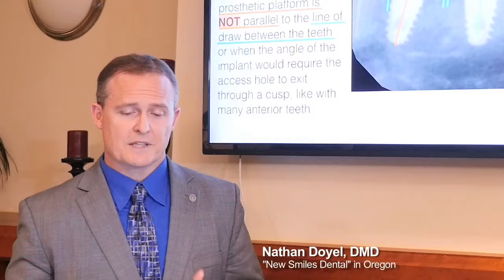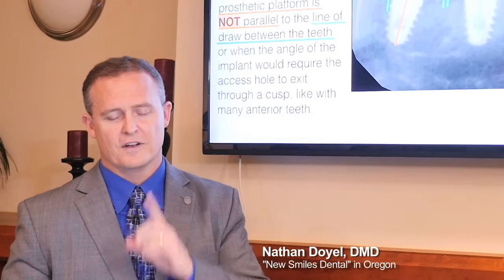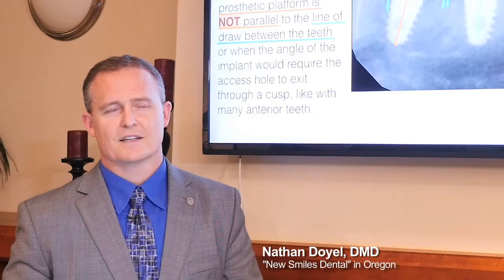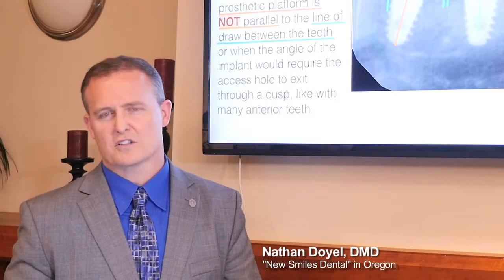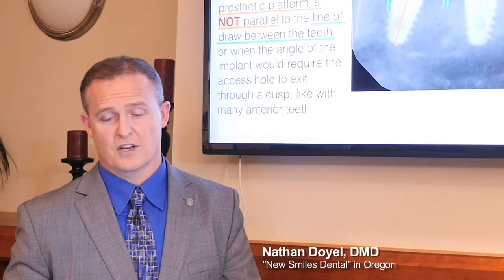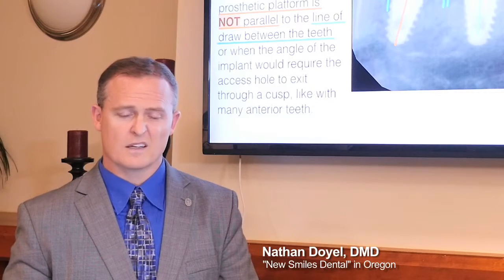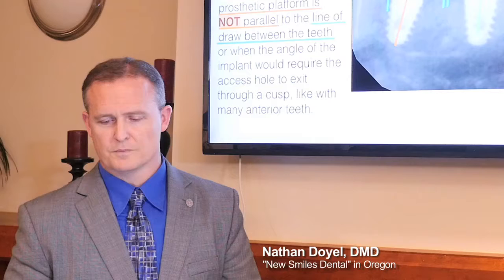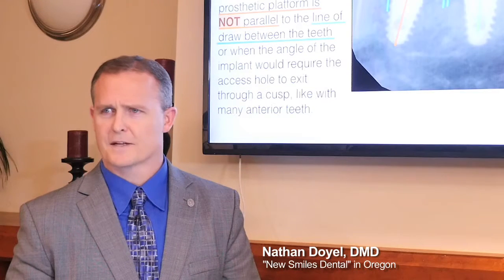So cement retain oftentimes in the anteriors, I'll cement retain because I would otherwise have the access hole coming through the center of the incisal edge, not a good plan, or at least close enough to it to be a concern, or thinning that porcelain out. So anteriors oftentimes I will cement retain. Posteriors, I follow this rule of the line of draw with the access of the implant. Hope that makes sense.